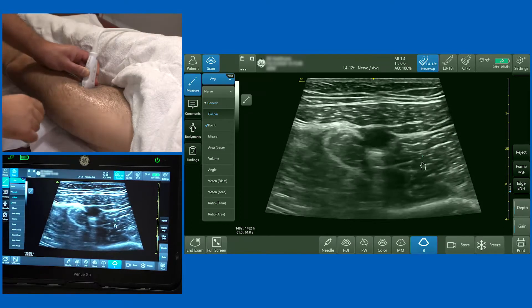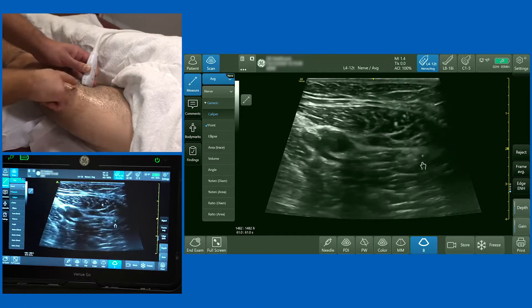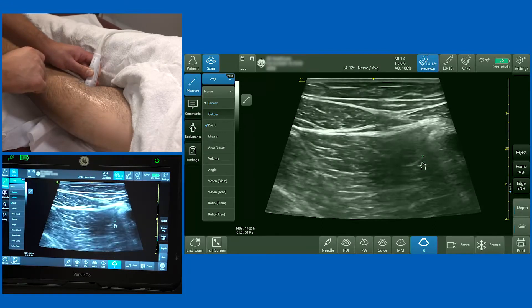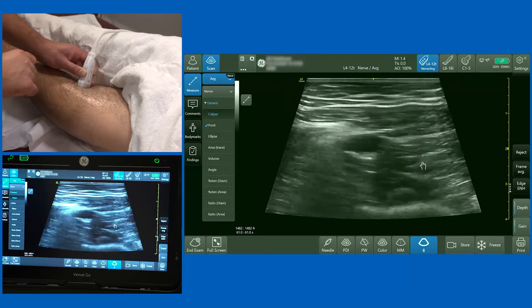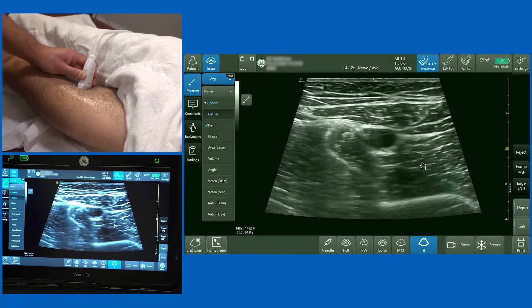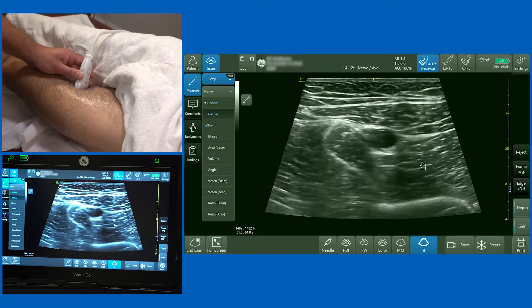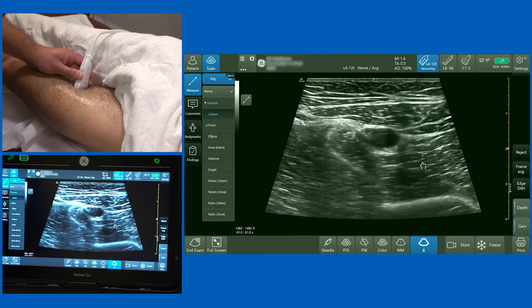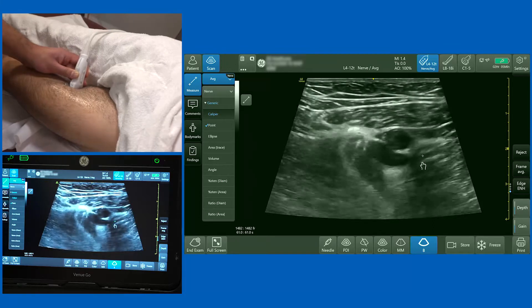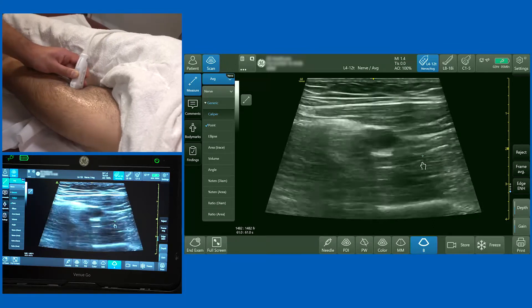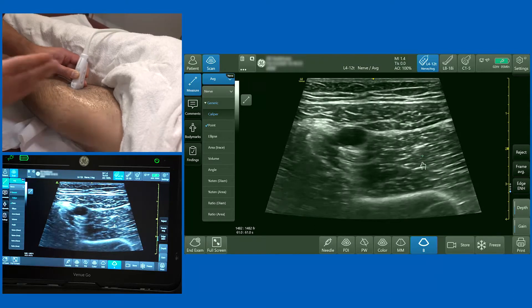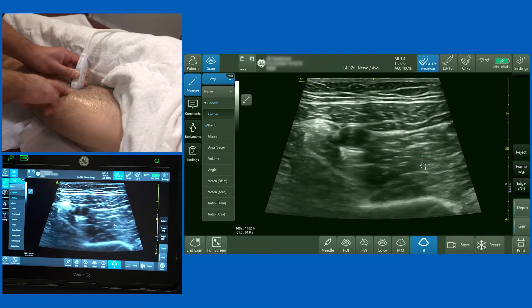On the right-hand side of the screen, which is lateral as we see it, is the vastus medialis, and medial to that are the adductor muscles. In order to perform an adductor canal block — or a femoral triangle block, because this is performed at the apex of the femoral triangle — you need to identify the superficial femoral artery and look for neural structures that tend to lie preferentially on the lateral aspect as you're standing there.